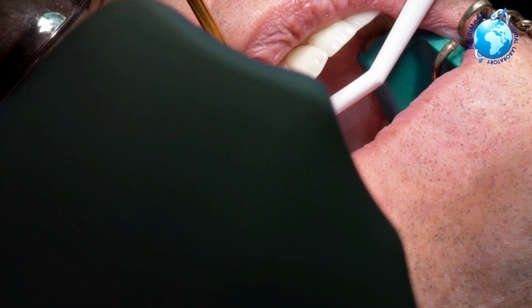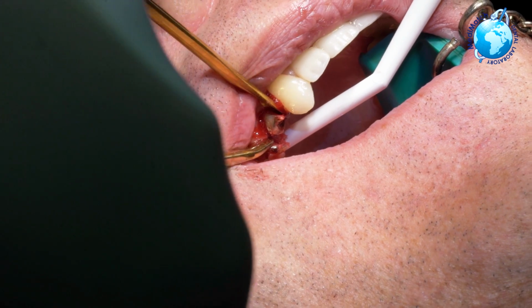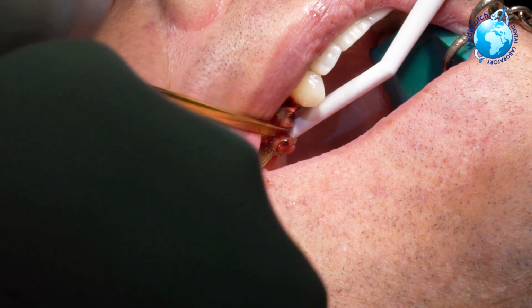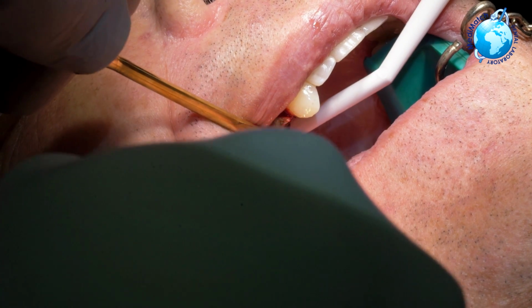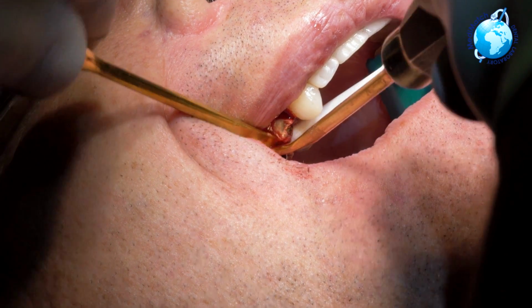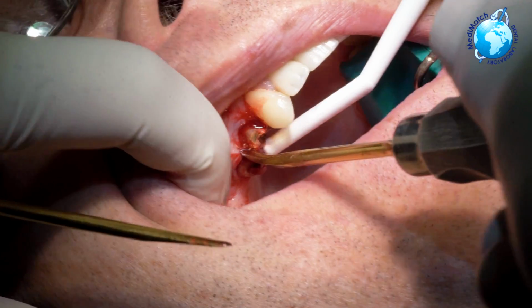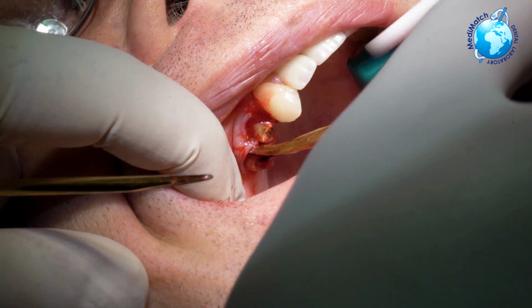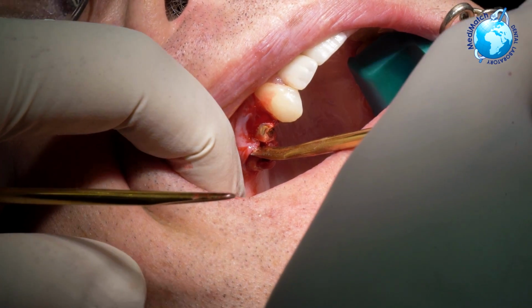Yeah. Okay, still working on that. Cleaning. Okay, tap tap. So a little bit more tapping now. Okay, Alan, well done.